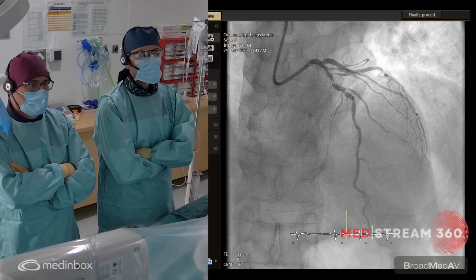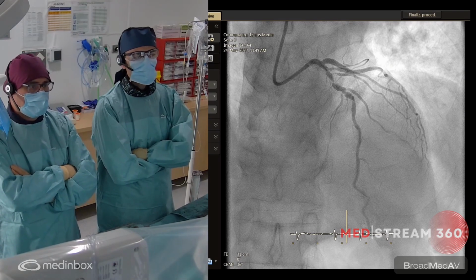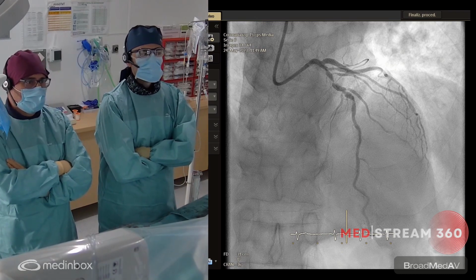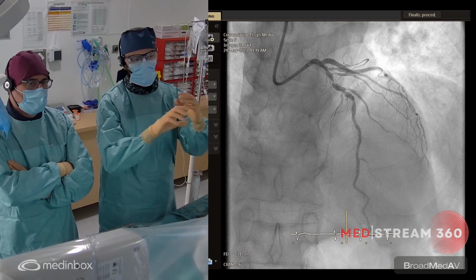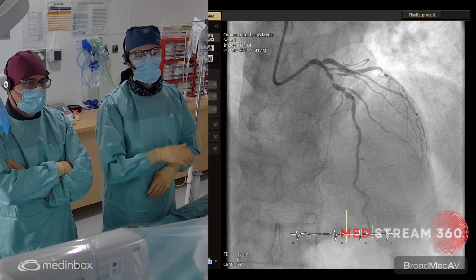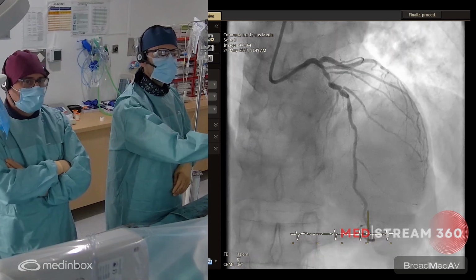Probably the bigger one is the proximal, logically, but the disease is probably worse at the ostium of the second and the third diagonal. And also after the more critical stenosis, there is an aneurysm, and we have been discussing covering the whole lesion, including the aneurysm, or using the proximal part of the aneurysm as the landing zone.